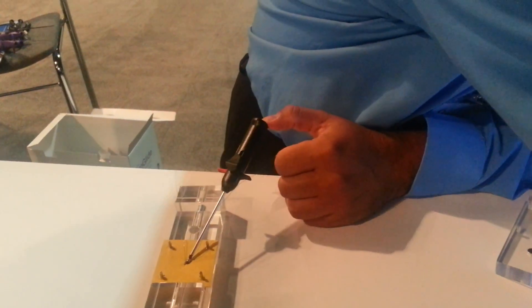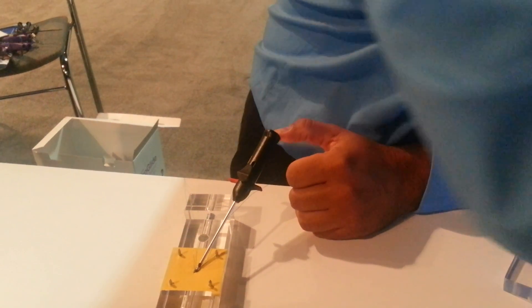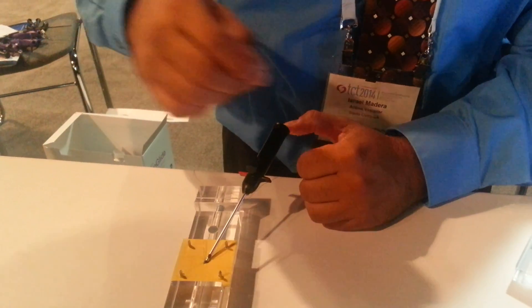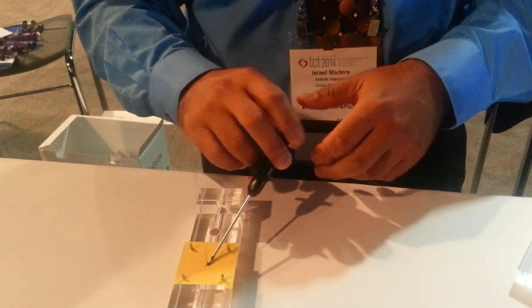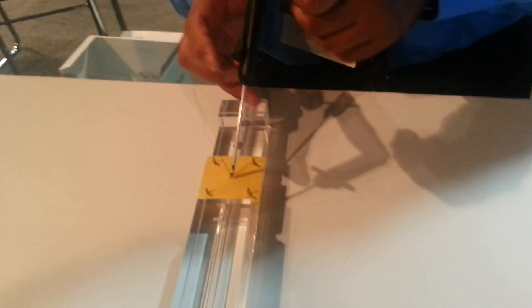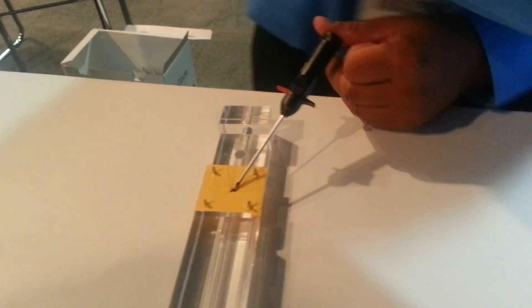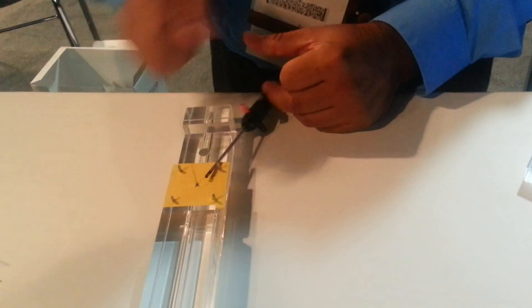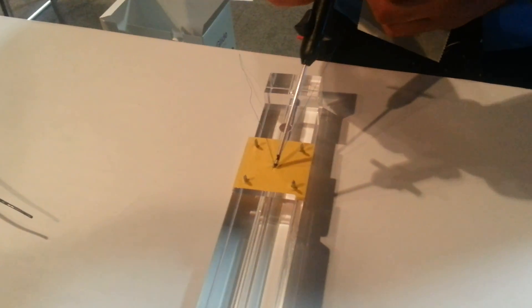Avoid the red. Open — this one opens it for you. Close it — at least close it. Then rotate it, coaxial — rotate it so it's like this, coaxial, stay down. Push the knot — yes, push the knot. This is the only time you're going to push. See how he's doing it? That's what we don't want to do. Don't push down on the knot — you just want to drop the knot down all the way there.